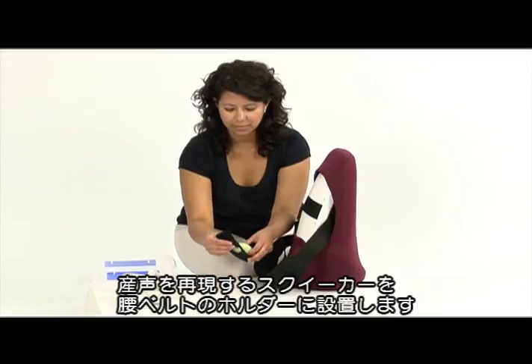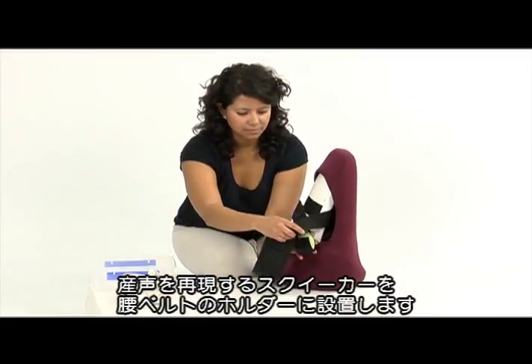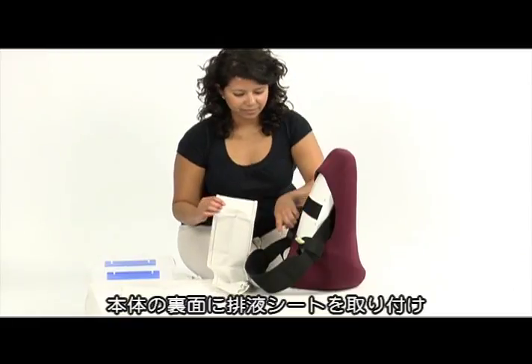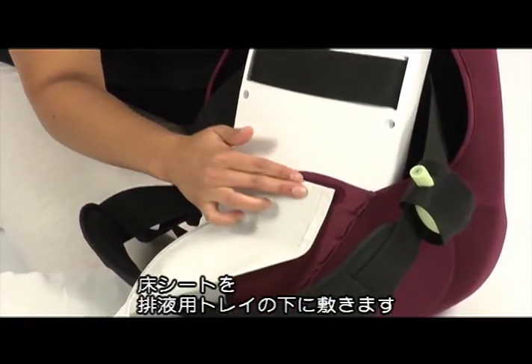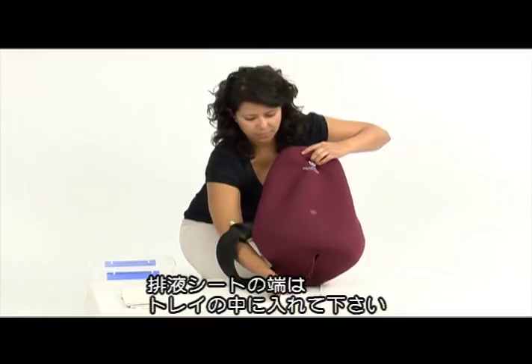Place the green squeaker unit from the Neo Natalie kit into the holder of the Mama Natalie waist belt. To avoid spillage, attach the fluid drain to the back of the skeleton. Place the floor protection under the collection tray, and ensure that the end of the fluid drain is inside the collection tray.